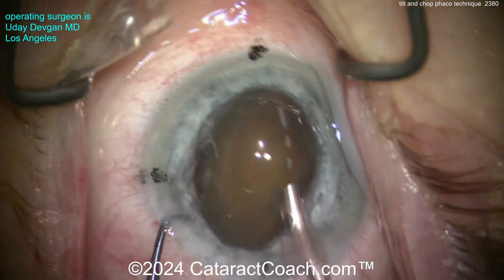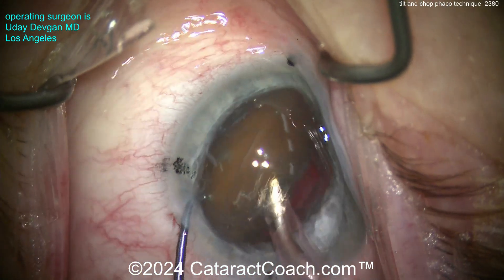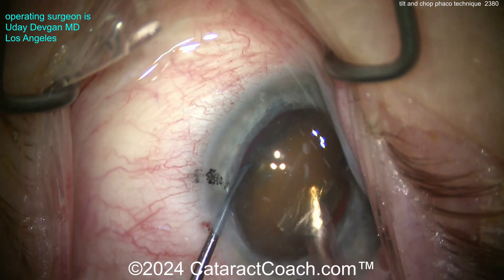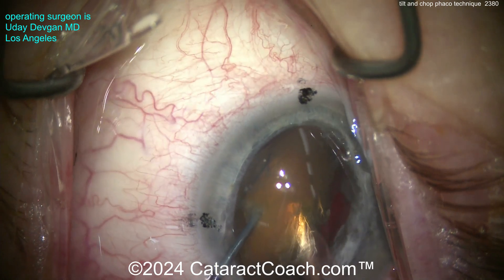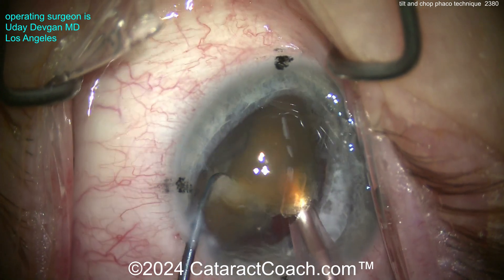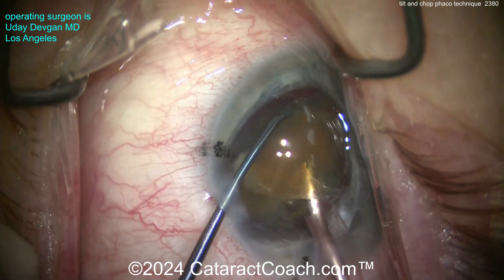Buzz into the nucleus right in the middle with the phaco probe. Now where does the chopper go? Around the back side — keep the eye in primary position, good reminder. And there's the chop right down the middle; you've now separated the nucleus into two halves.